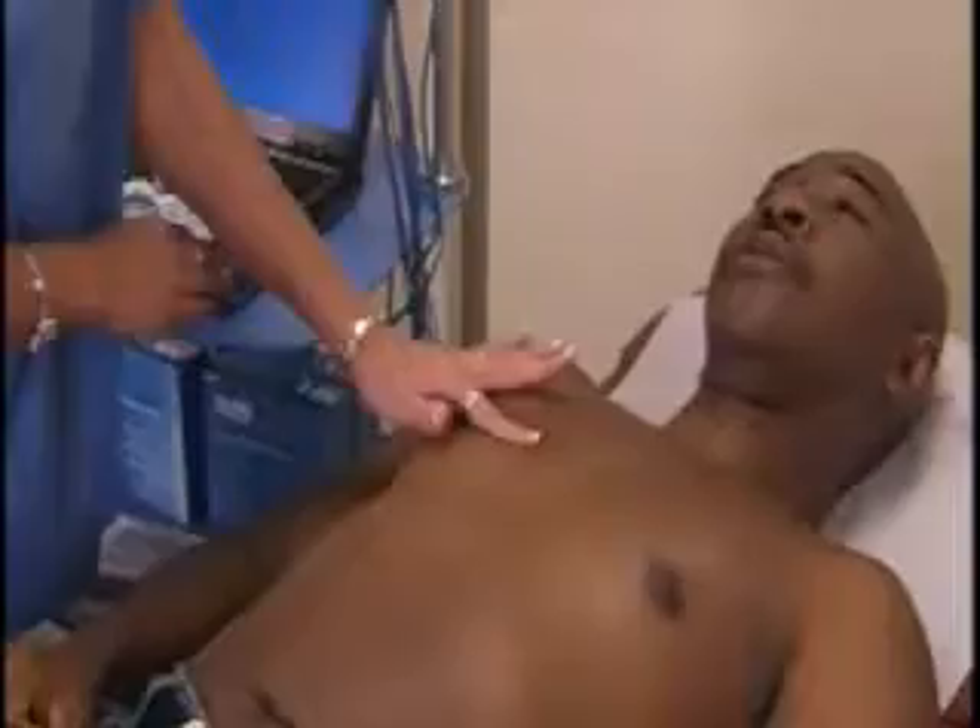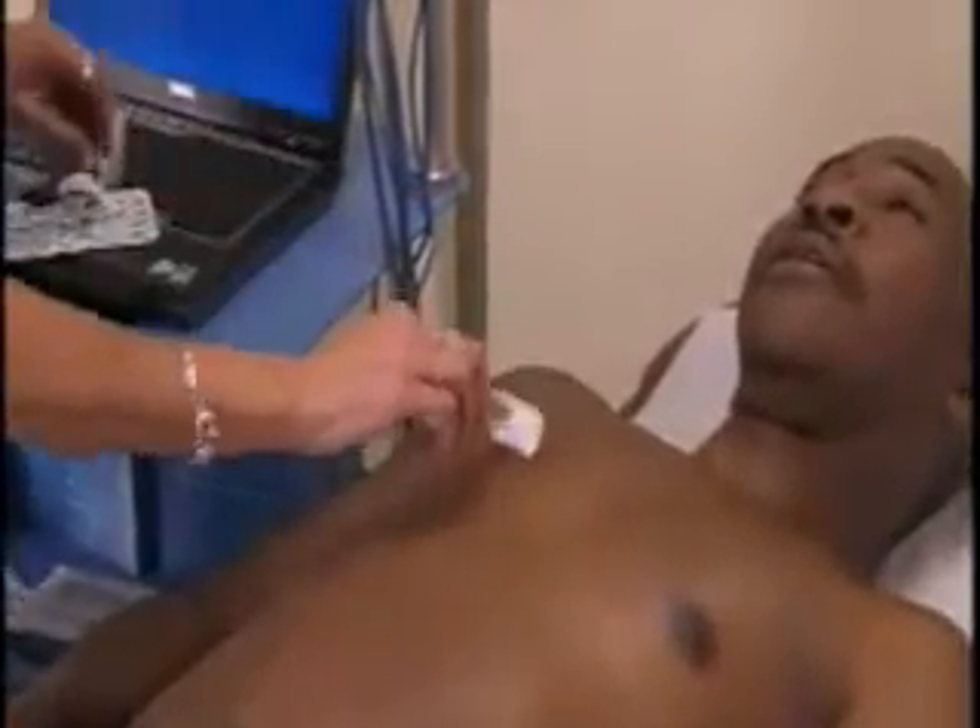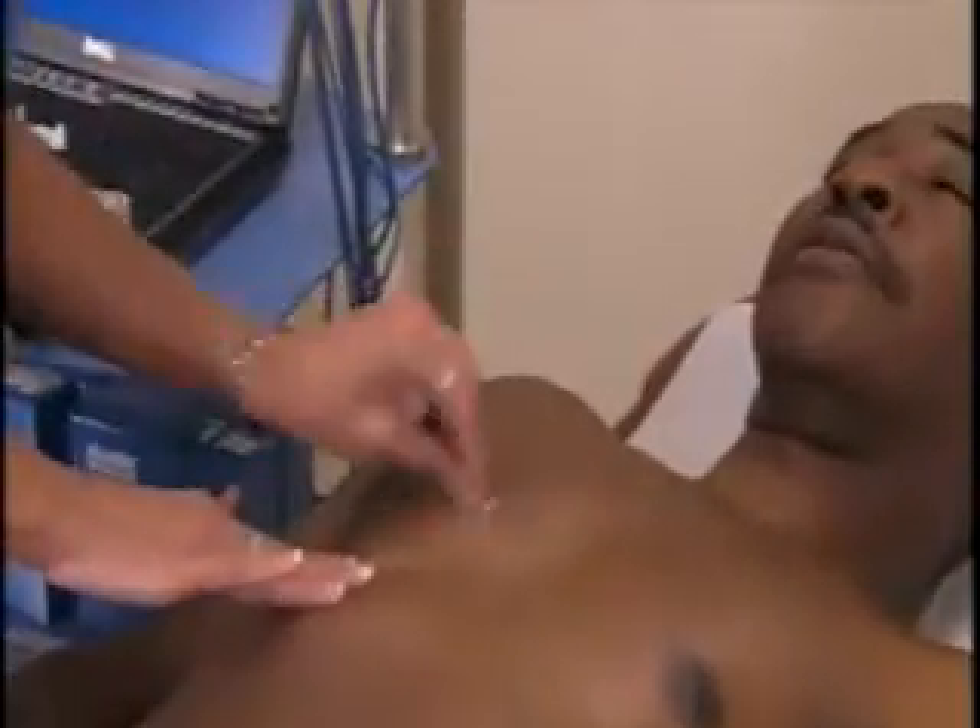It is very important that you explain to your patient that all preparation steps, including shaving the hair from the electrode sites, must be done. Proper preparation will assure optimal resistance between the skin and the electrode.